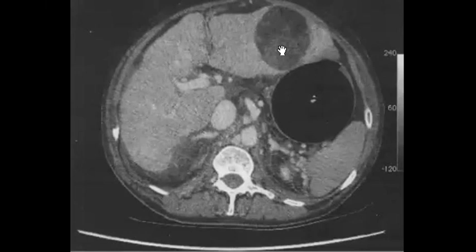You can think about other types of cirrhosis; it is not always the typical type of cirrhosis that you see, especially in Egypt. There is another type of cirrhosis that can happen. Which type of cirrhosis do you expect to show this fatty degeneration? So it will be secondary.